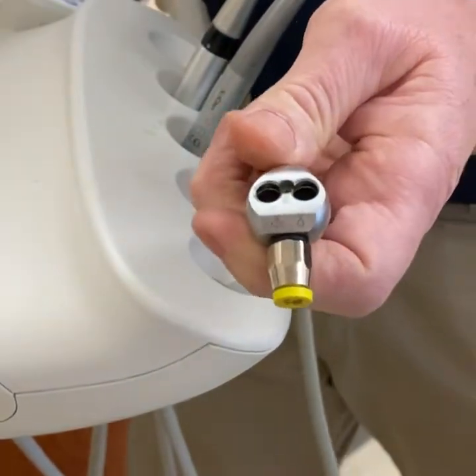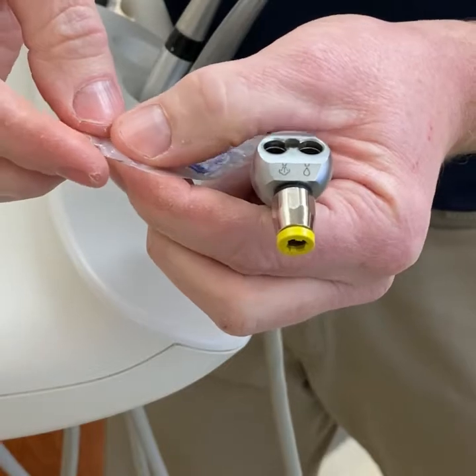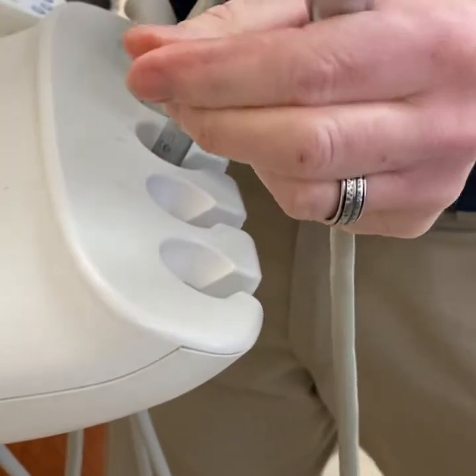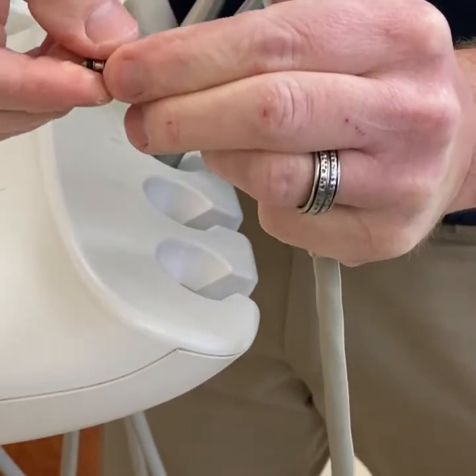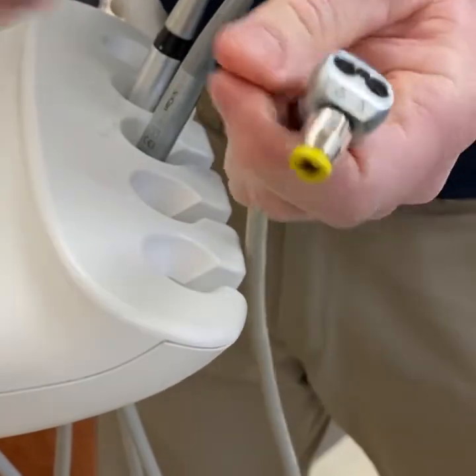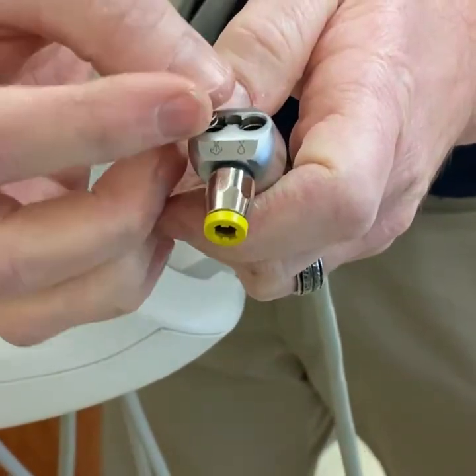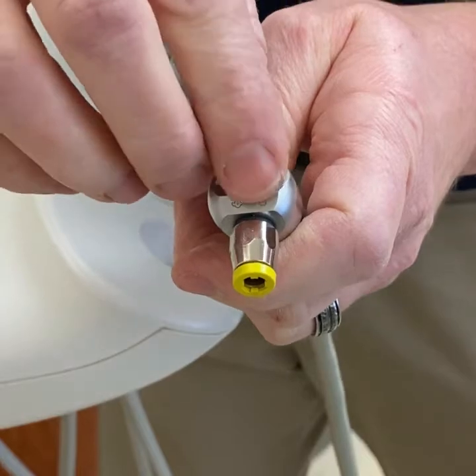Then we'll install the new buttons. The button install kit comes with silicone lubricant — just take a little bit, you don't need a lot — and coat the o-rings on the buttons. The springs go in first, with the large end going in first and the smaller opening on top, so it almost looks like an upside-down ice cream cone. Put both of those in.